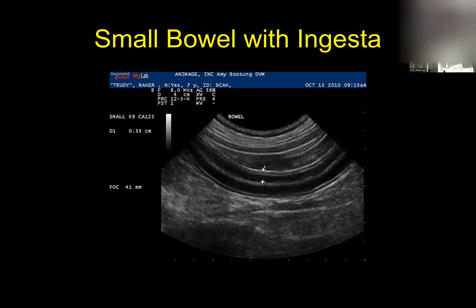Okay, having heard no complaints, I will continue on. So here is a section of duodenum. This is a section of bowel that's running right across the screen. Now the first thing to know is, again, the bowel wall has layering. So the outside margin of the bowel, which is the outside serosal layer, is this nice, well-defined, crisp white line. That's the outer margin of the bowel loop. Right next to it, there is a thin outside black line, meaning towards the outside of the bowel wall. That's the muscularis, the smooth muscle part of the bowel wall.